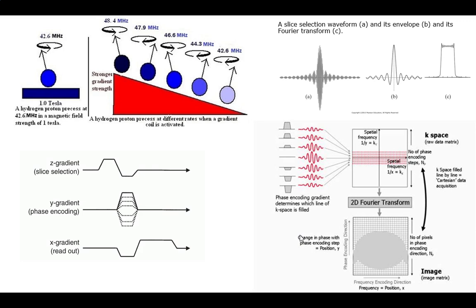Remember, I picked my echo, that little kick to cause it to re-resonate and recombine. If I set that echo time so it's peaked for dephasing at a particular level, the faster ones go away, the slower ones haven't peaked, so you just get the one you care about. So now you've picked a Y level by how fast you set the dephasing. So now all you have to do is determine left to right.